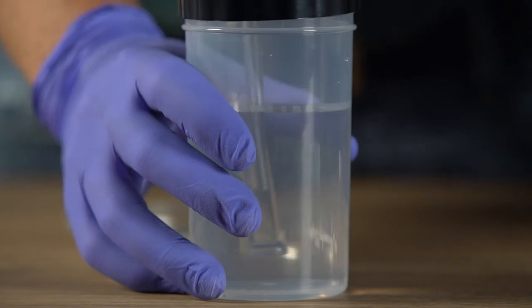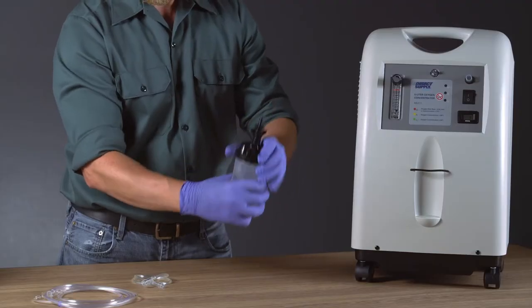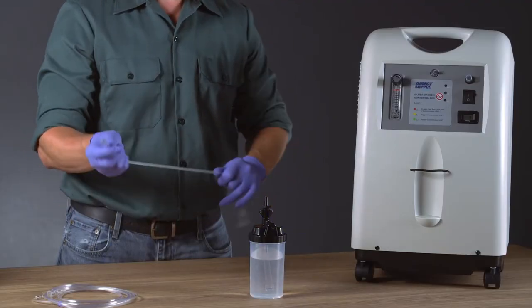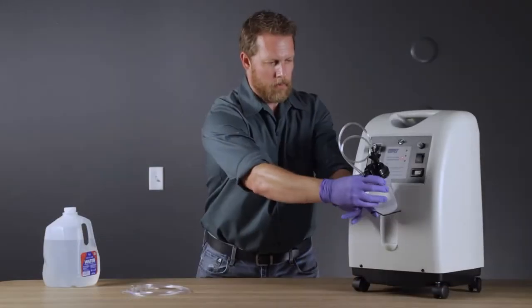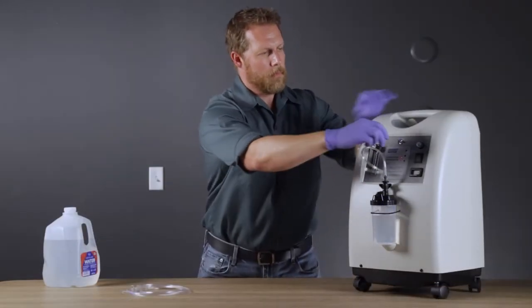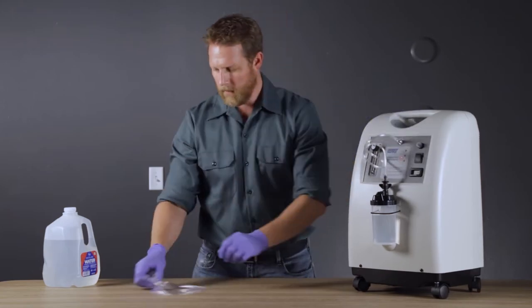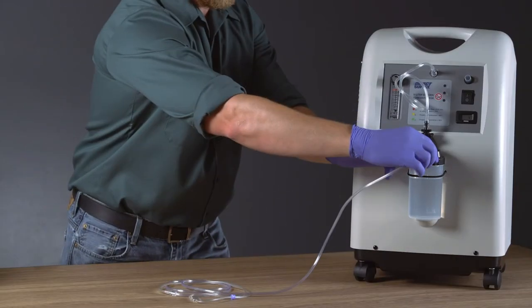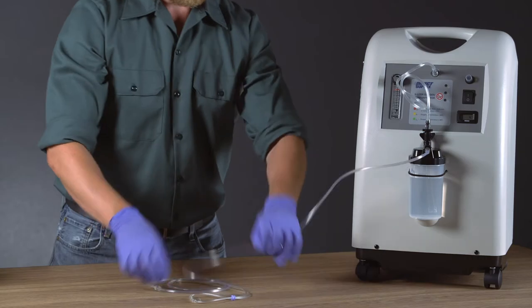Screw the cover back onto the humidifier bottle and connect the Oxygen hose. Insert the humidifier bottle into the elastic strap on the front of the concentrator and then connect the Oxygen hose to the Oxygen Outlet on the concentrator. Attach the nasal cannula to the humidifier bottle.